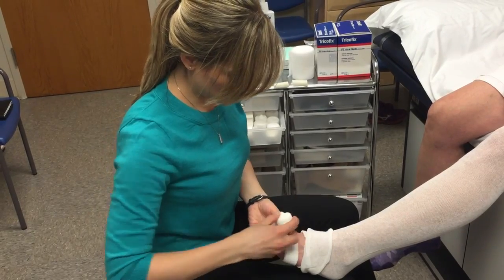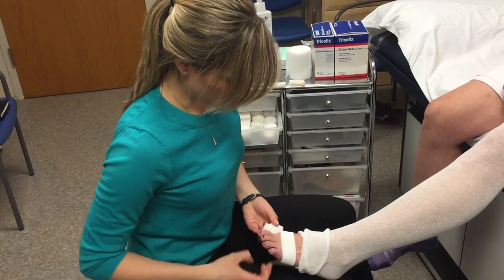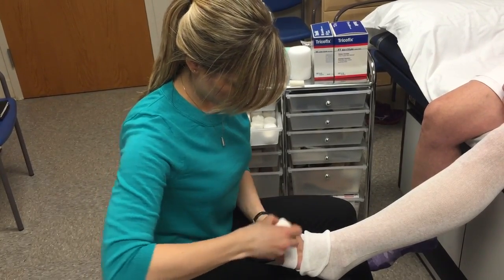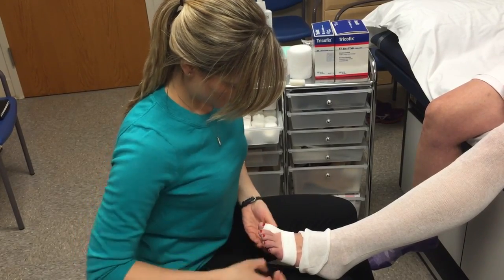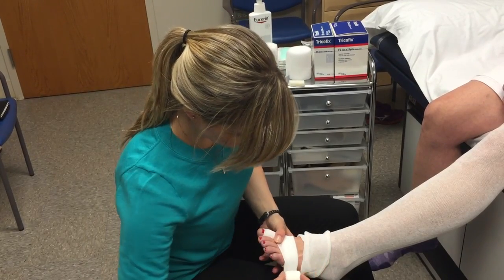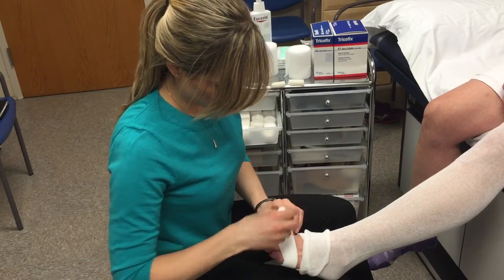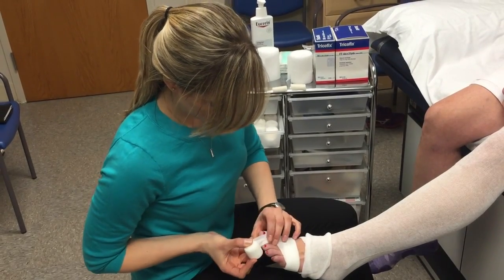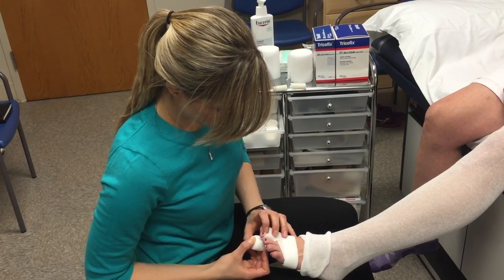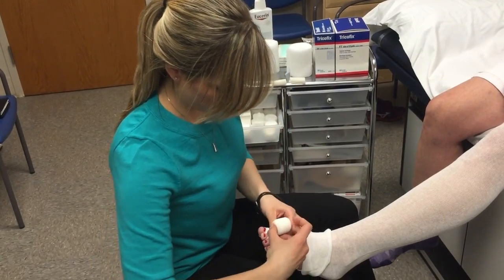Make sure that you wrap the toe entirely so there's good coverage. And then once you feel like there's good coverage, go ahead and go around to where you started, and then down to the next toe, starting just below the nail bed, and then work your way up.